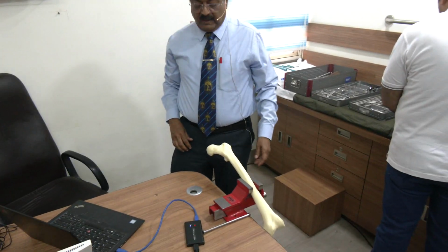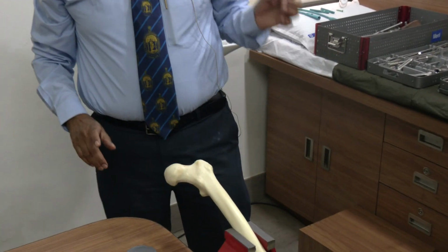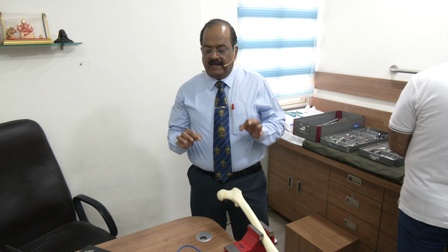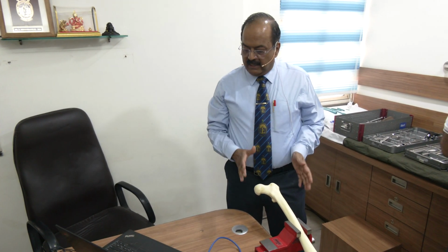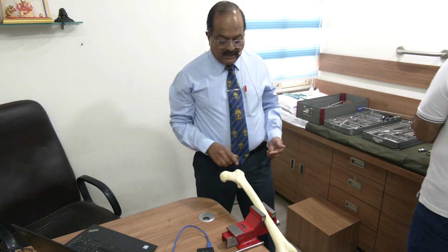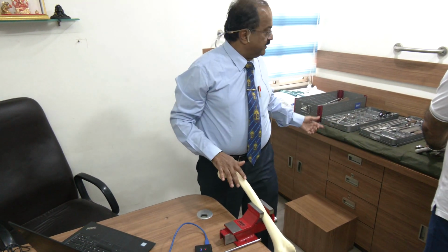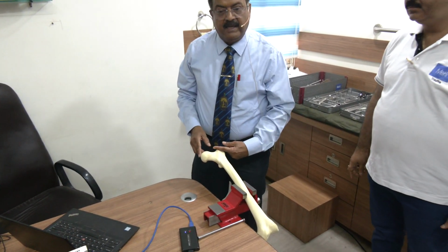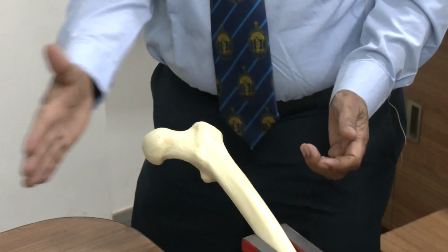Yes, fine. Okay, so this is the bone model. First, I will do the demonstration. While I'm doing the demonstration, I'll explain in detail each and every instrument we are using. As I said earlier, if there is a fracture, I fix it with K-wires. The advantage of fixing with the K-wire is you can adduct the limb.